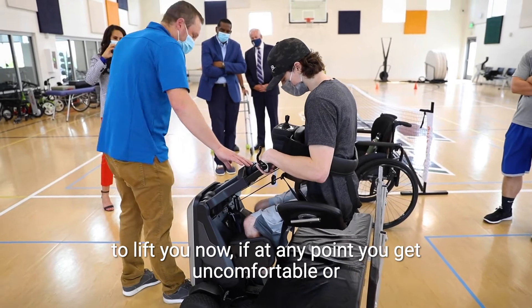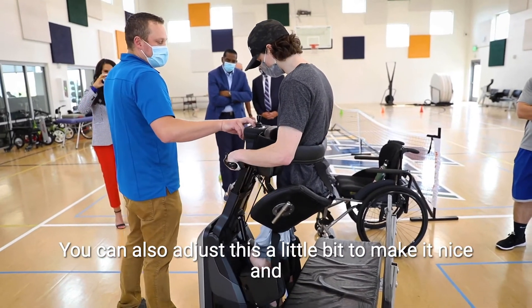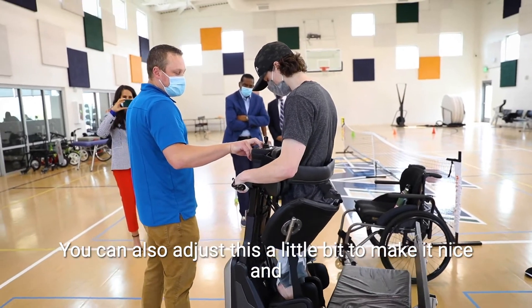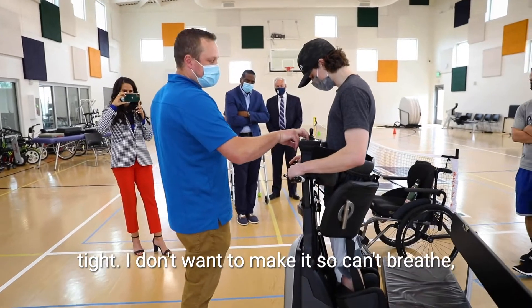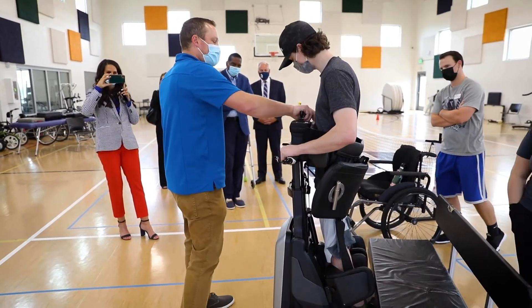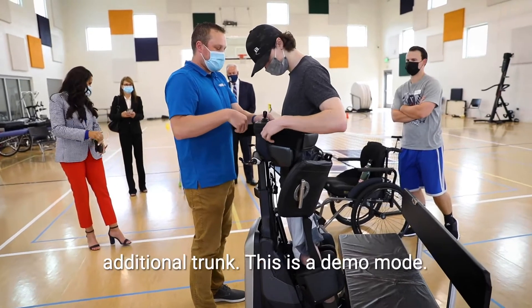If at any point you get uncomfortable or anything, you can stop and lower yourself back down. You can also adjust this a little bit to make it nice and tight — I don't want to make it so you can't breathe, but you can snug that up. Same thing with the back support, just to give you some additional trunk support.